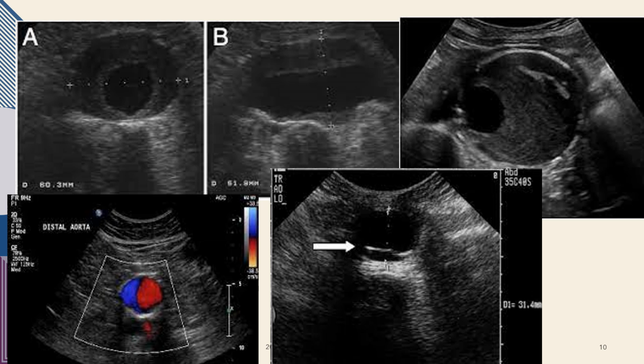So in this case, you would typically measure your transverse image just like usual, and then you would go back and you could measure the diameter of the true lumen that still continues, just to make record of that. Now in B, this is actually the same aorta in long at the same region.